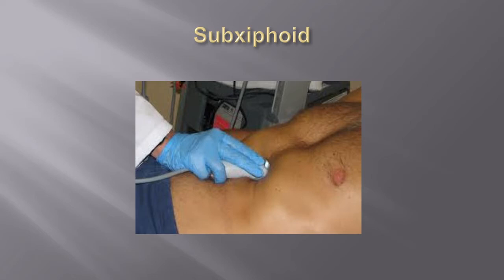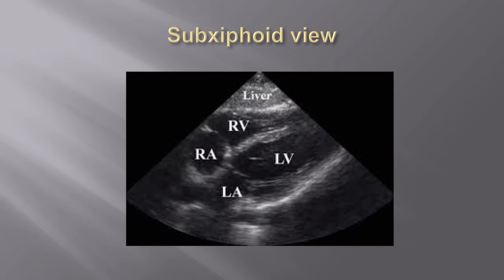It'd be very nice if all of our patients look like this, but we know they don't, okay? This is the view you're looking for, all right? So this is a great image, because what you want when you look here is you don't want a lot of liver in your view when you're doing the subxiphoid view, because you're trying to get the cardiac view.